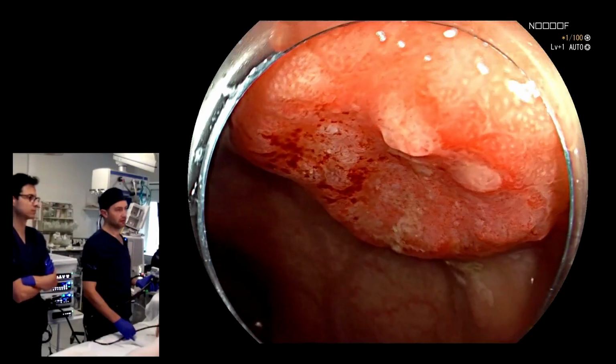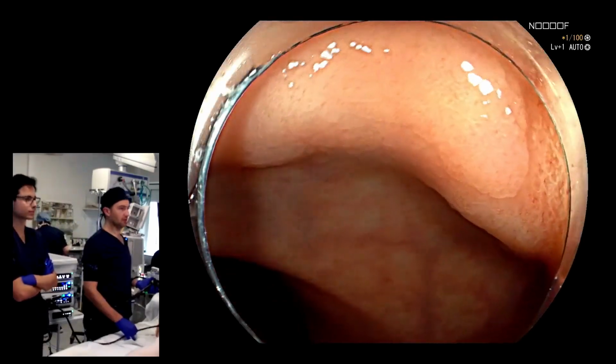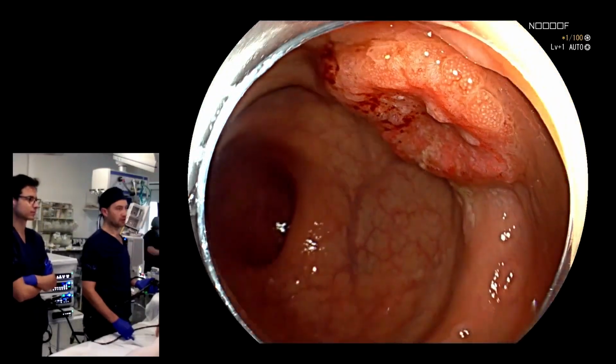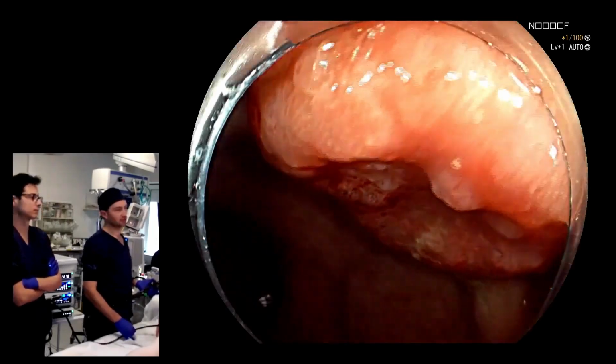I'm here with also Andrea Sorge from Milan in Italy. What would be your approach to this, Andrea, in terms of further characterization? Because I guess the question we want to get out there is, you see something like this in your endoscopy list, what's the next move?